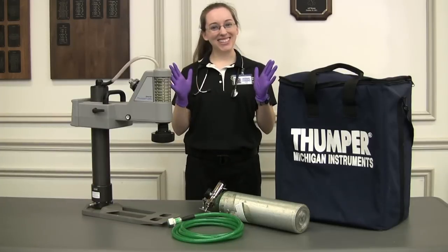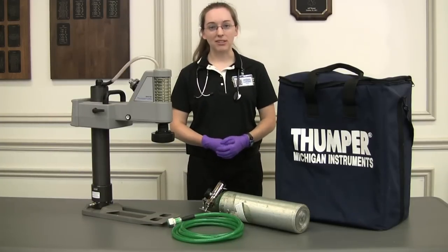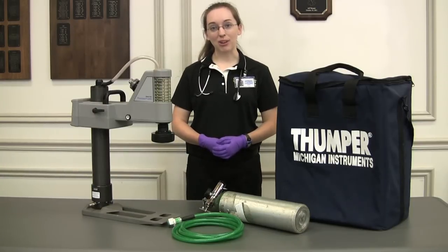Hi, I got my VSI on. Today we're going to be reviewing the Michigan Instruments Thumper CPR System, model number 1007. But first, let's go through the parts.